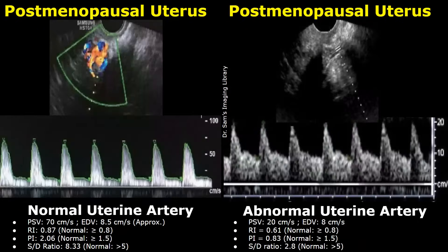Now we will look at uterine artery Doppler waveforms in a postmenopausal uterus. The values are slightly different. In normal cases, the resistive index should be greater than or equal to 0.8. The pulsatility index should be greater than or equal to 1.5, and the SD ratio should be more than 5.